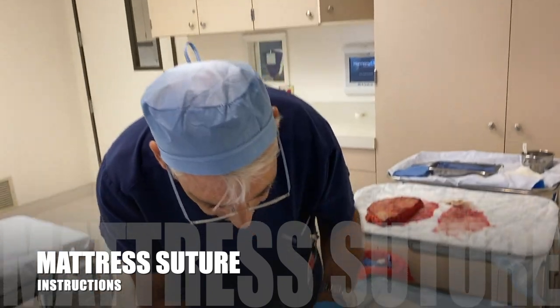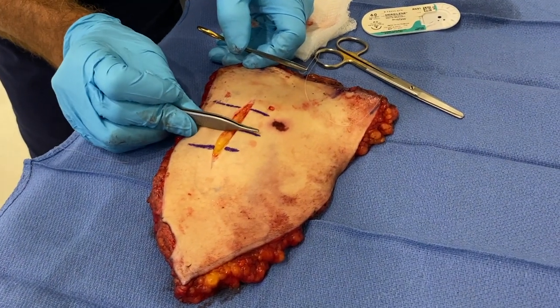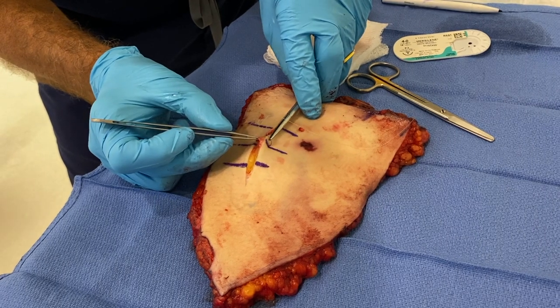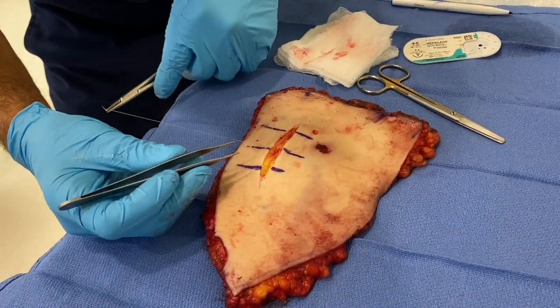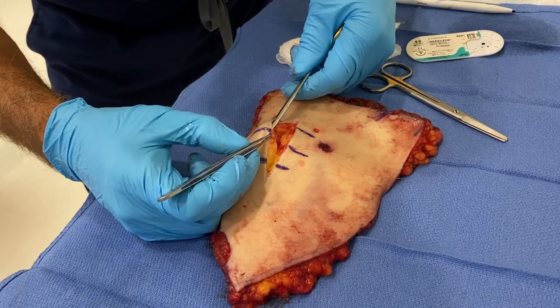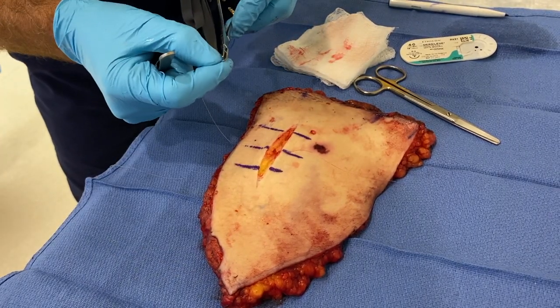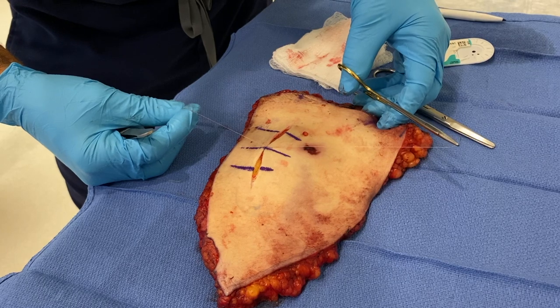Now we're going to do a mattress suture — a vertical mattress, meaning all of my stitch is going to be going in this direction. First, I'm going to pick up my tissue by the dermis and go in relatively far away from the margin. Then I'm going to go straight across, picking it up by the dermis so I don't crush the skin. If I keep holding on to the tissue with my pickup, the needle won't be able to go anywhere. Now I have my simple stitch.